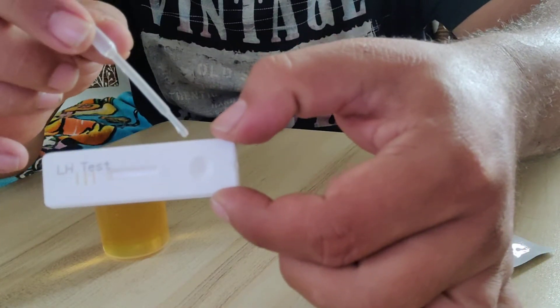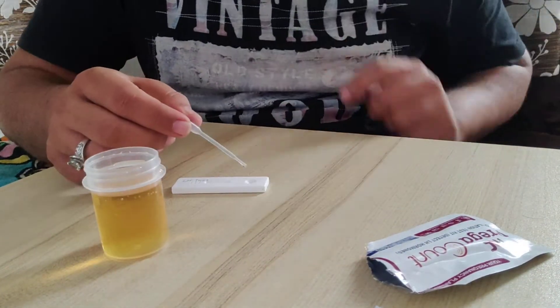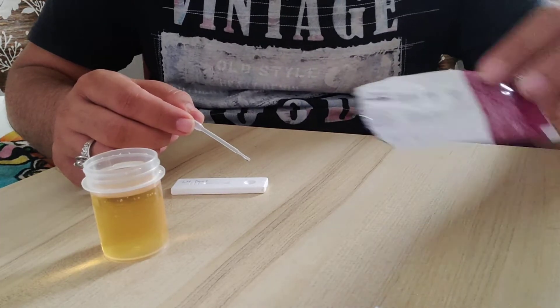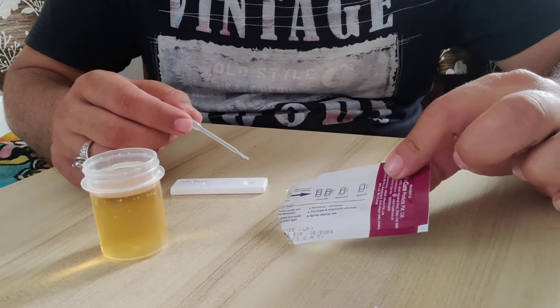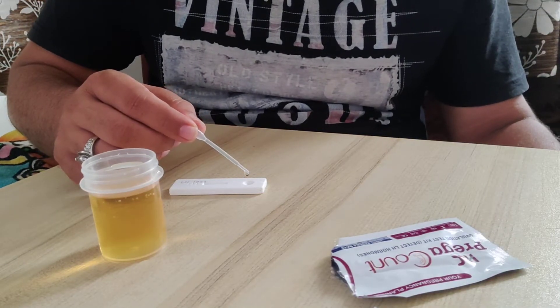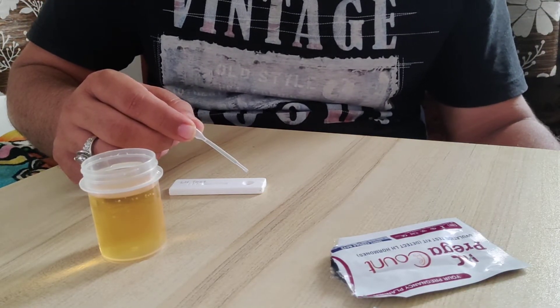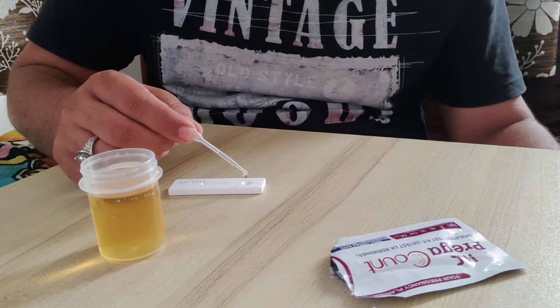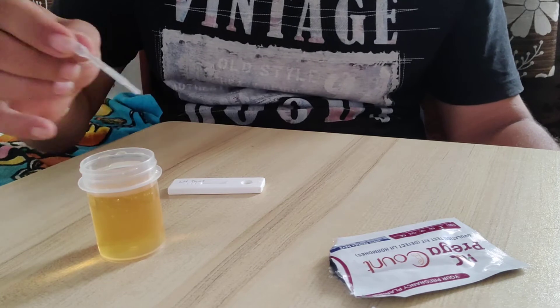Take your sample and drop it into the sample well — the small round well. The instructions on exactly what has to be done are printed on the foil. Just put two to three drops and finish.